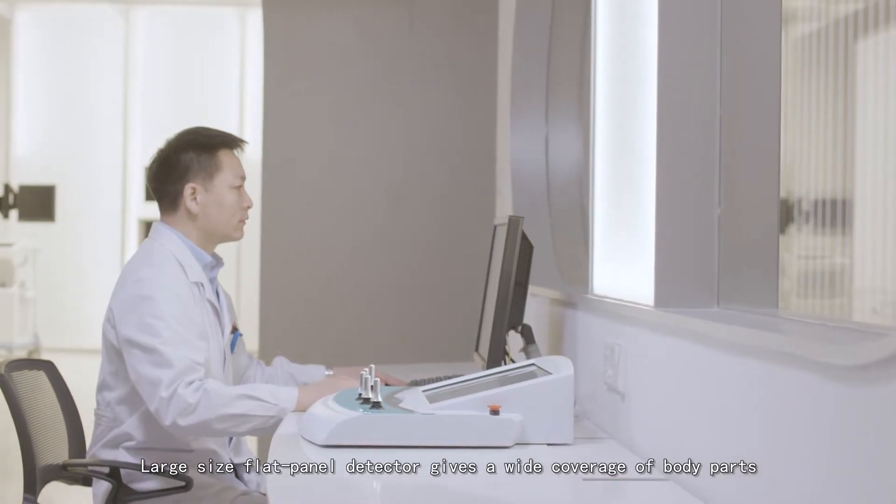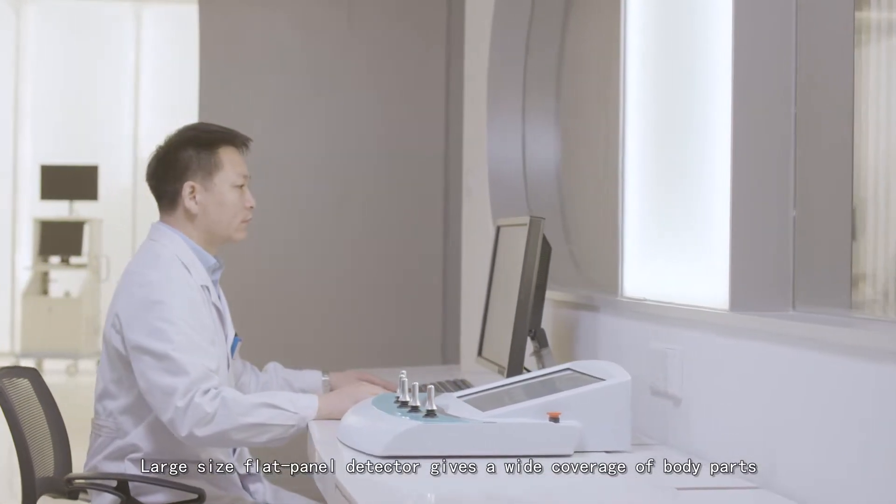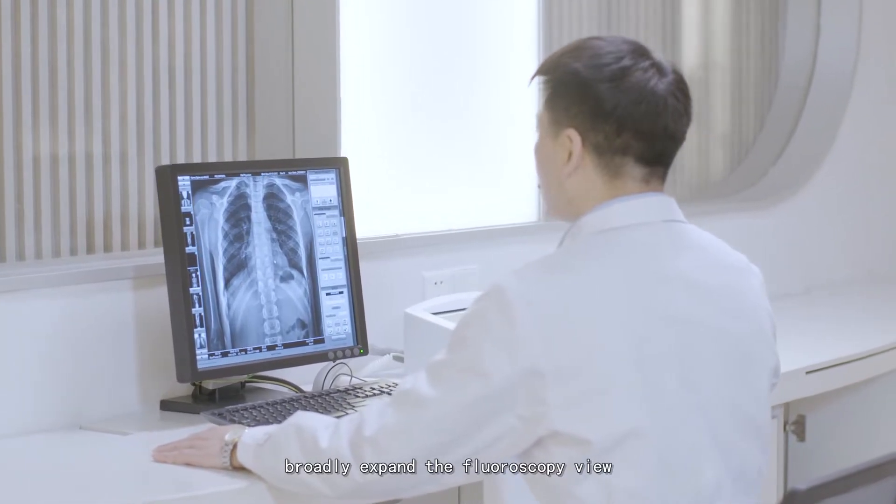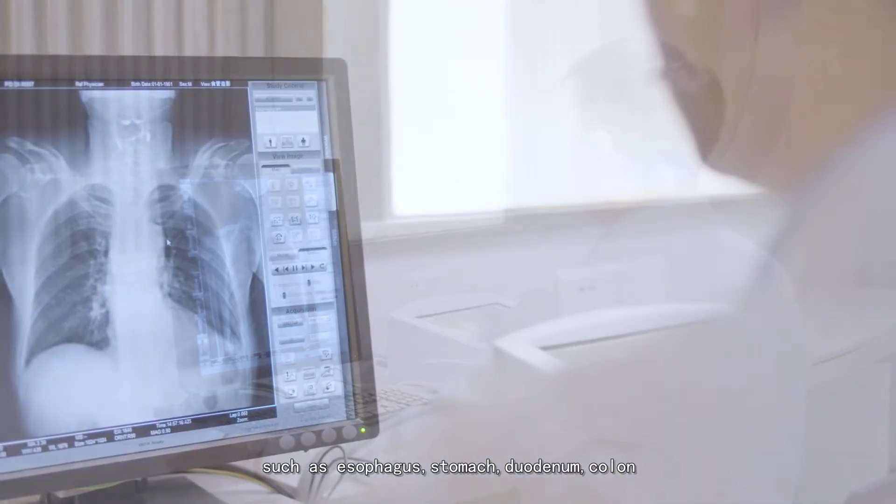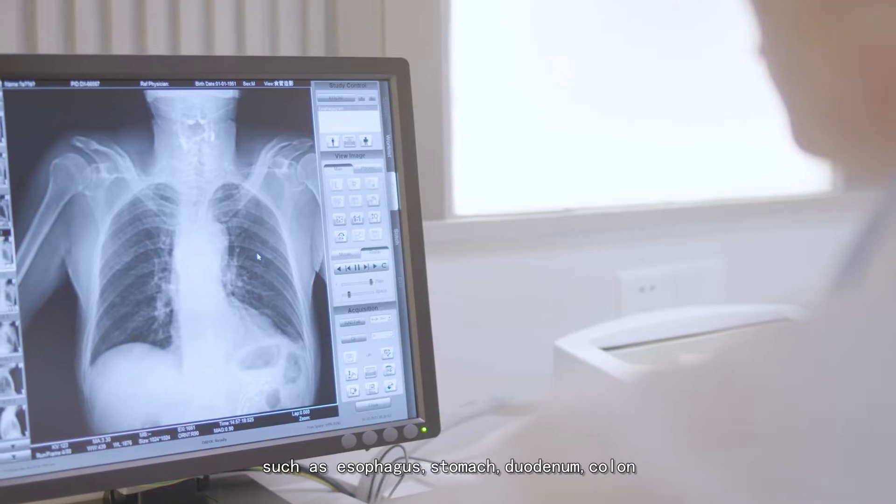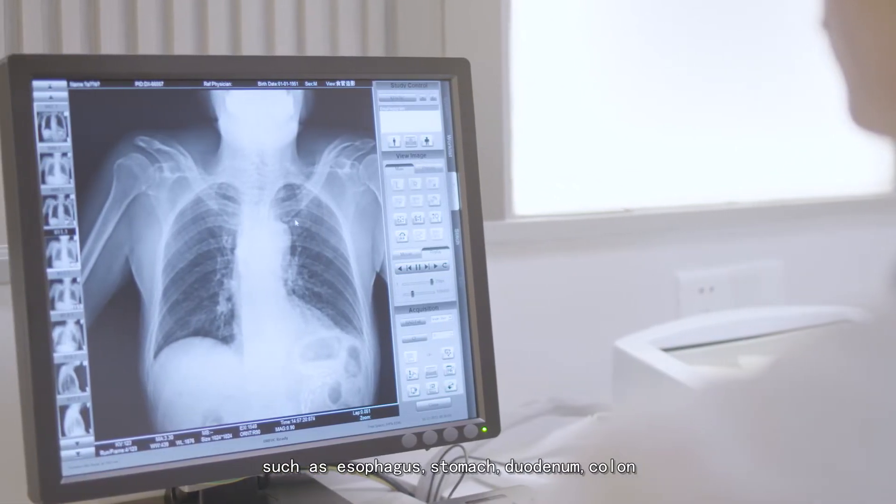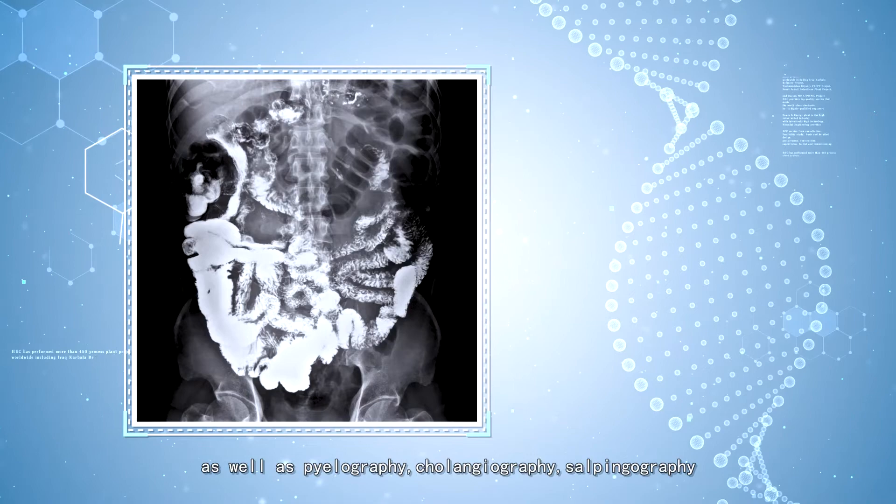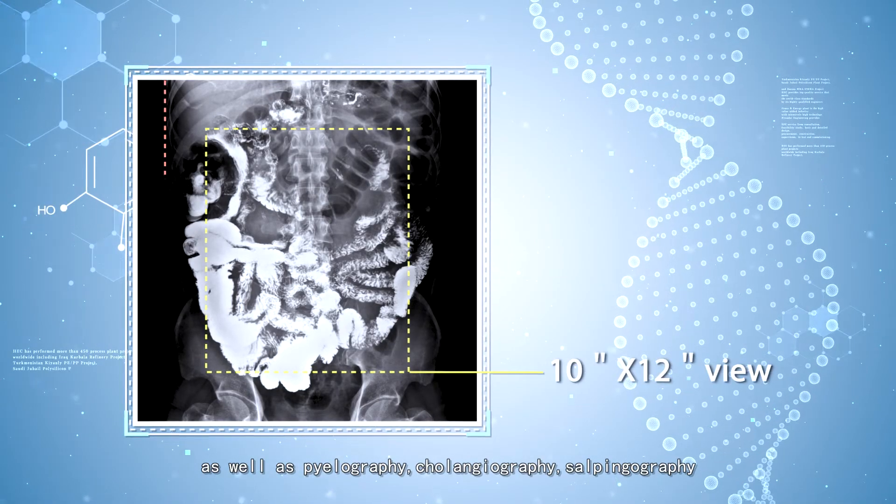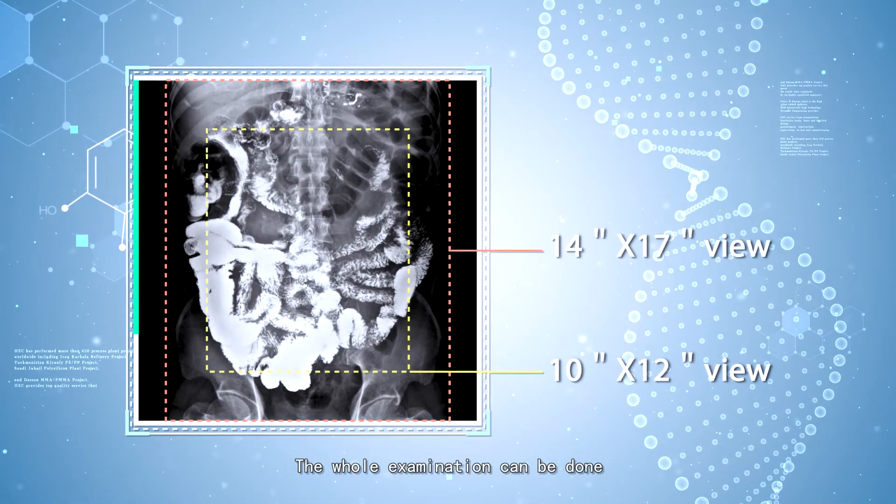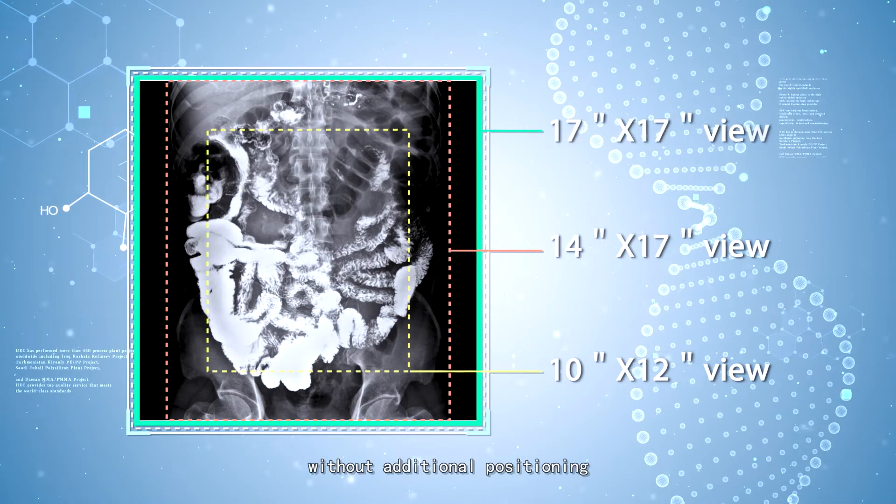Large-size flat panel detector gives wide coverage of body parts, broadly expanding the fluoroscopy view, such as esophagus, stomach, duodenum, colon, as well as pyelography, cholangiography, and salpingography. The whole examination can be done without additional positioning.